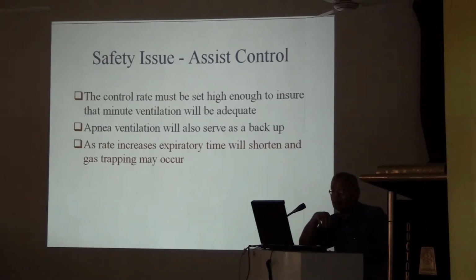This is only mathematics. If the rate increases, expiratory time will shorten and gas trapping may occur. This is another important thing, known as auto-PEEP. I will tell you in detail because it is a very important feature for any ventilator. There is stagnation of air. If you don't give enough time to exhale, what will happen? There will be a pent-up of air, and gradually the lung will inflate, and a time will come when it will burst. I will tell you later about this auto-PEEP generation.